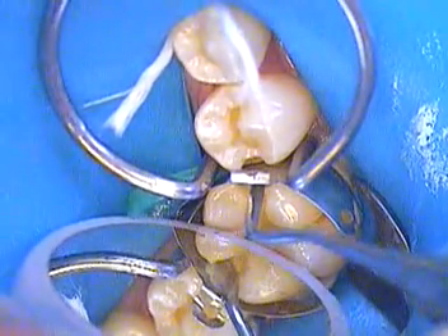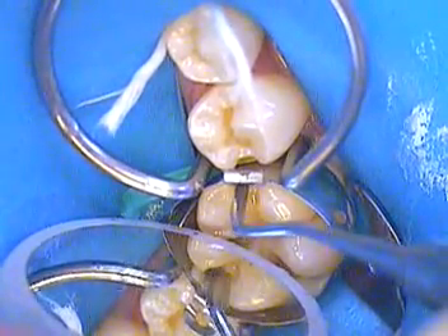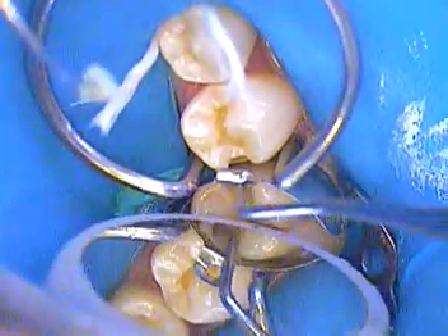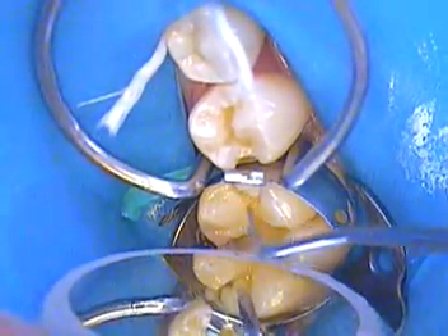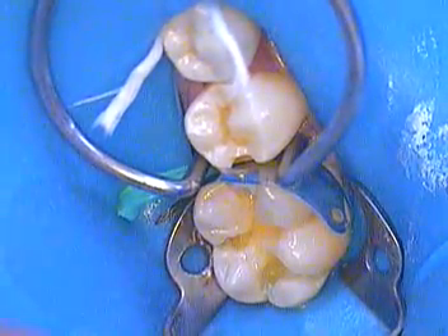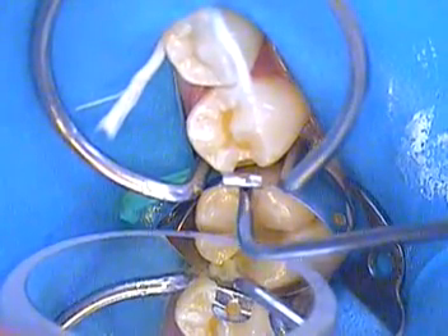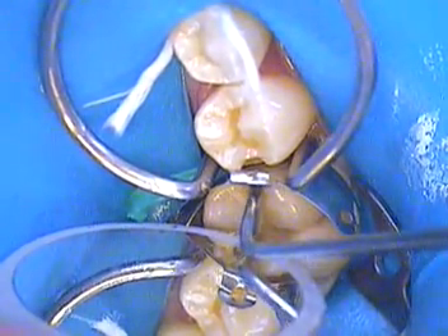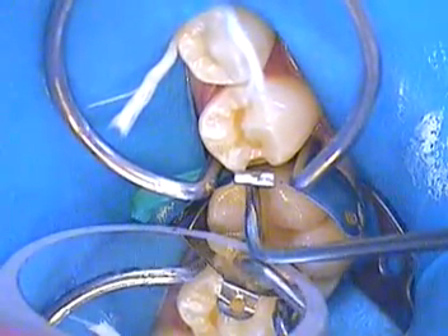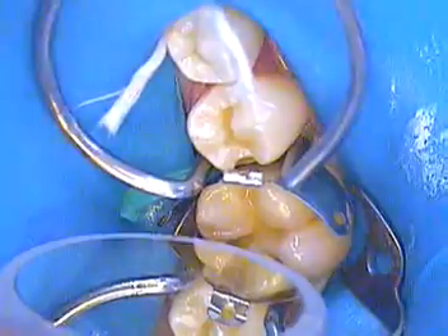Now we can condense that down in there with a condenser. A lot of these instruments we modify — we make them a lot smaller because they don't fit. We've got to make them smaller; we're being more conservative. Then we're building up, trying to build up the mesial marginal ridge here.